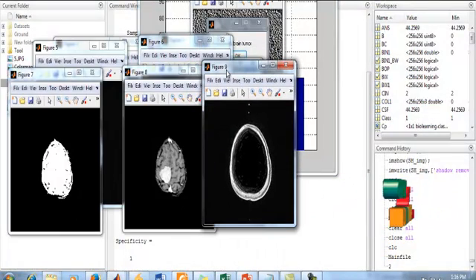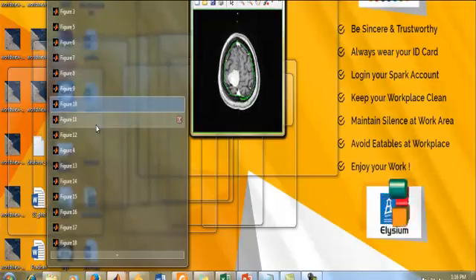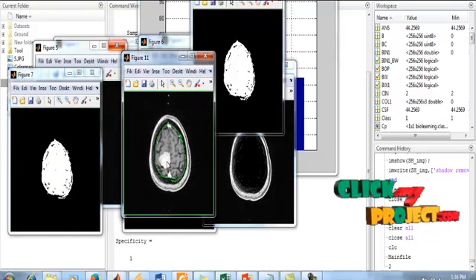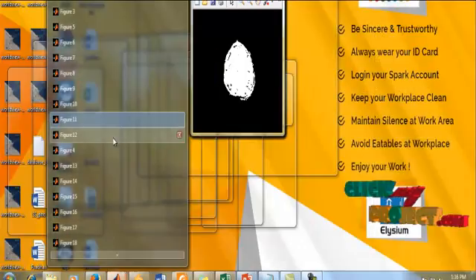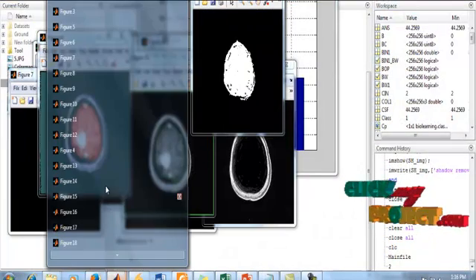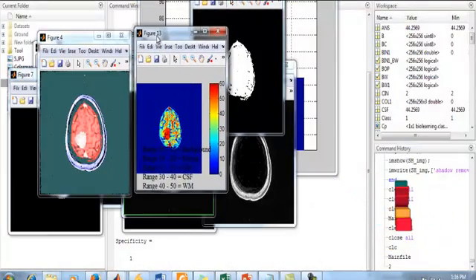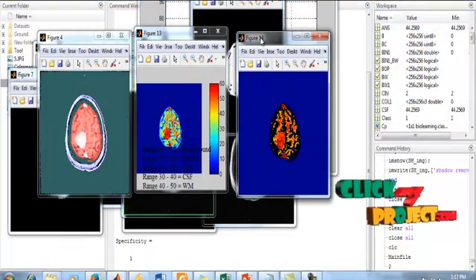Figure 9 represents the skull region. Hence figure 11 represents the boundary detection using the contour segmentation method. Now these figures represent the SOM segmentation method.